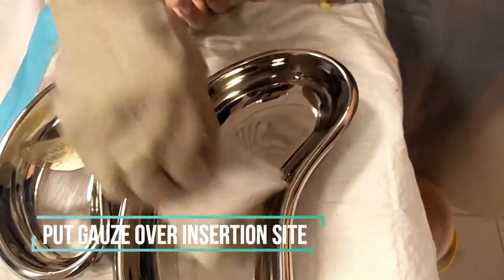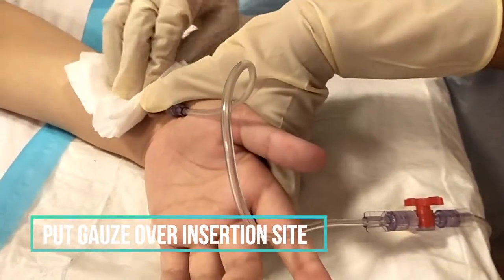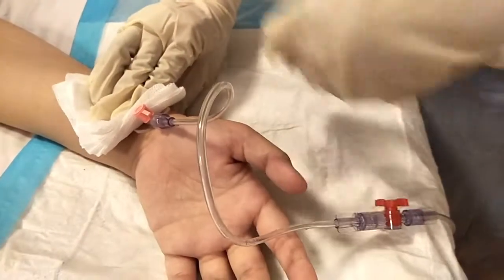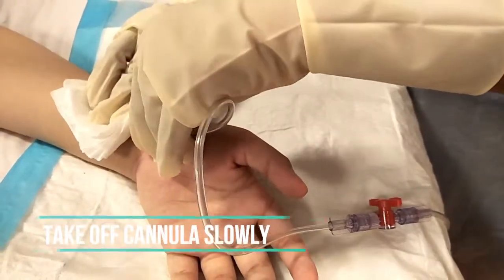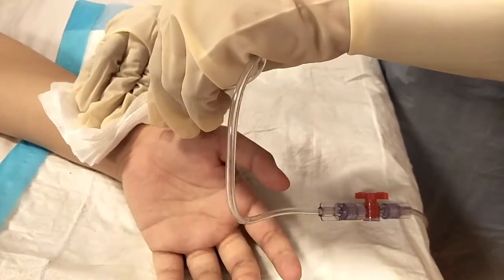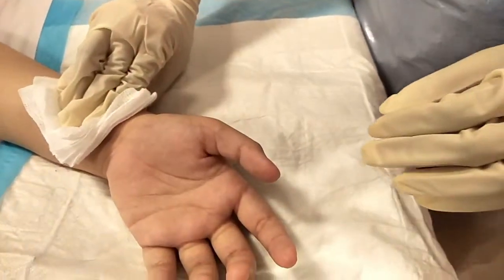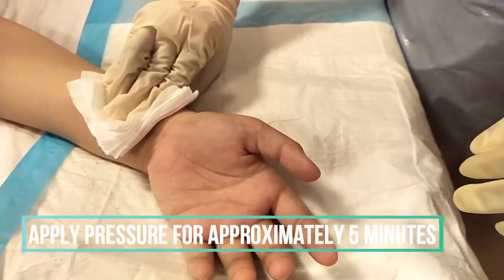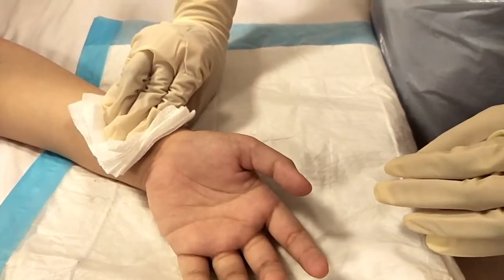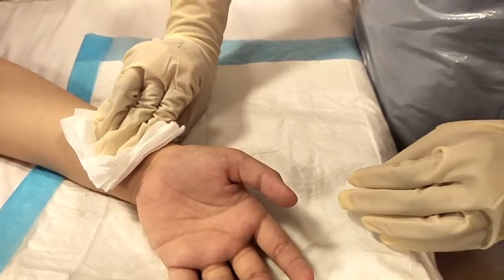Put the gauze above the insertion site and put pressure on the gauze. Slowly take off the arterial cannula while putting pressure on the gauze to reduce blood flow. Maintain the pressure on the gauze for approximately 5 minutes to ensure the blood does not flow out and to ensure enough time for the bleeding to stop.